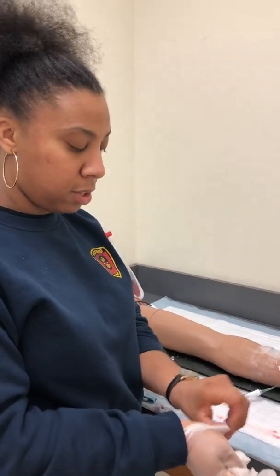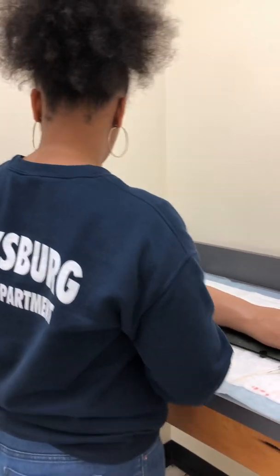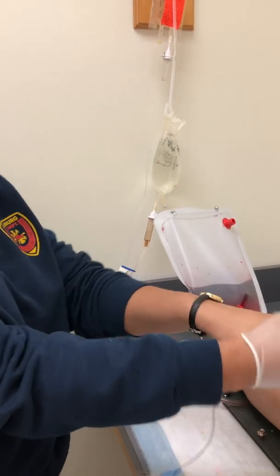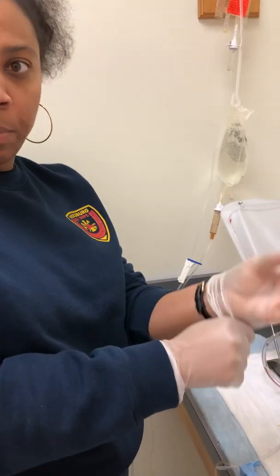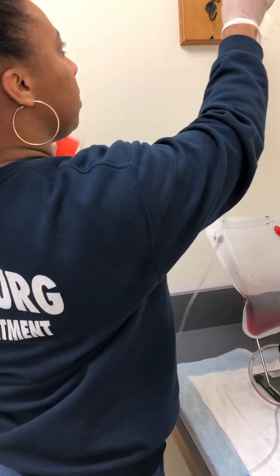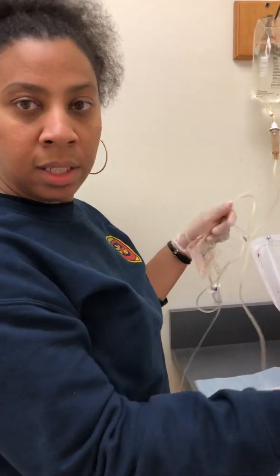After the patient has received their medication, I would take these gloves off, and I will come in and disconnect the secondary line. I'm gonna go ahead also and put a fresh pair of gloves on while I'm disconnecting. Also, this will be the time you can still continue to educate your patient about signs and symptoms to look for, any type of output or anything like that. So I would disconnect. I will bring my primary tubing back up. Get rid of this. Put my primary tubing back at its regular rate, whatever it was, and that's my assessment.